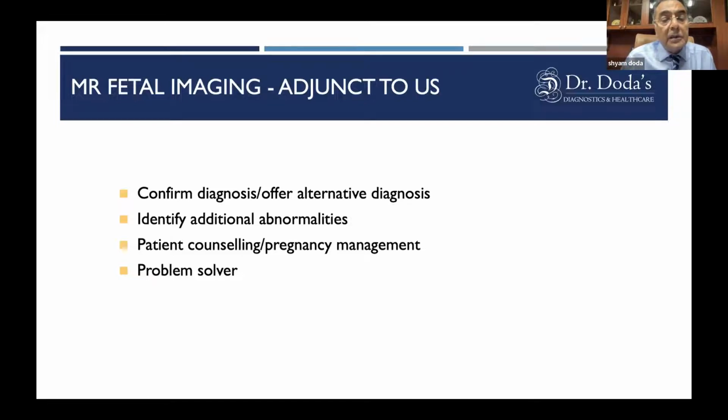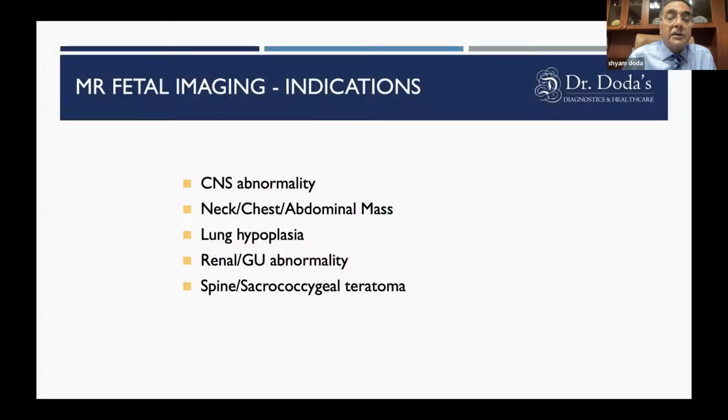And there is no doubt that MR helps in difficult cases, where you are not very comfortable and you want to take the help of a second imaging modality. There it helps to confirm diagnosis or offer alternative diagnosis. It identifies additional abnormalities, and that all helps in better patient counseling and management. And it does act as a problem solver in such situations.